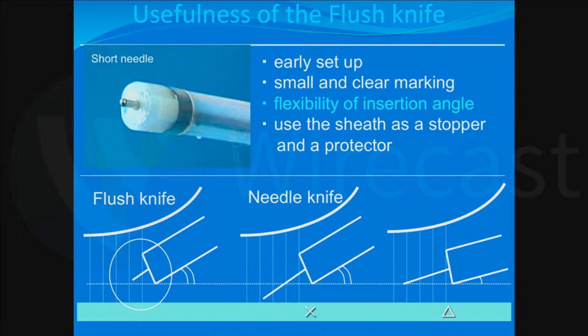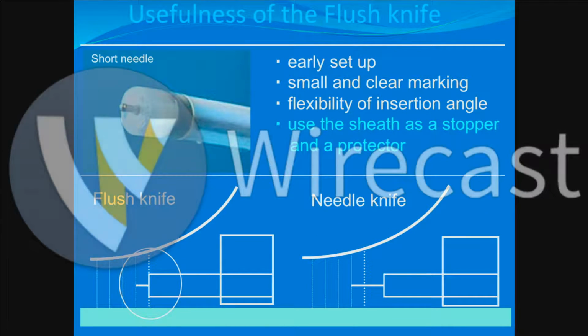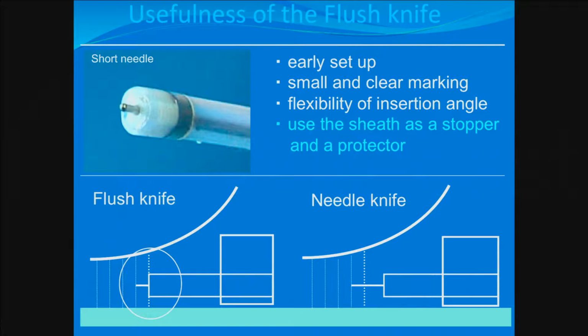Using the tip of the sheath as a guard, the knife is easily and safely handled to incise and dissect tissue with a slight tension and effect under direct observation.